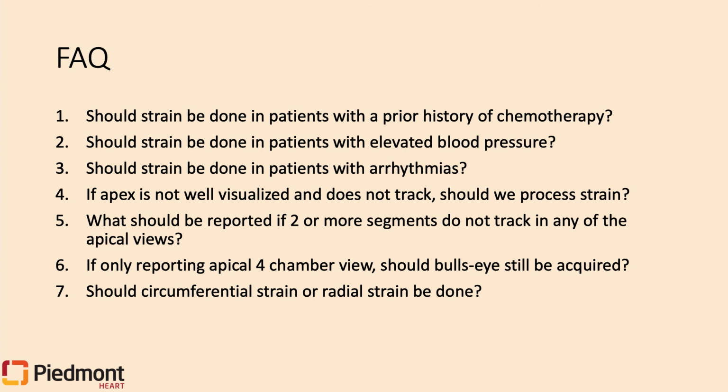Some sites have been doing circumferential strain, and if you want to continue doing that just for practice sake and for your interest, by all means go ahead. But the expectation right now is for us to try our best to acquire longitudinal strain on as many patients as we can, get comfortable with getting good images for strain, tracking strain, optimizing our acquisition so that we stay on par with our guidelines and with the trials that are coming out. And then as more information comes out about the other strain modalities, we will be ready to adopt them as well.